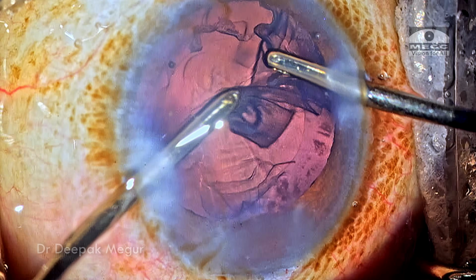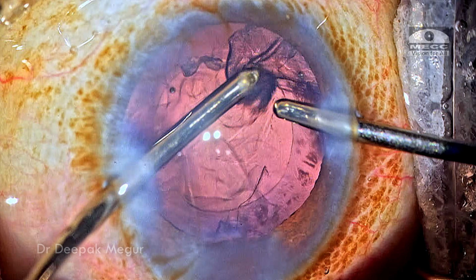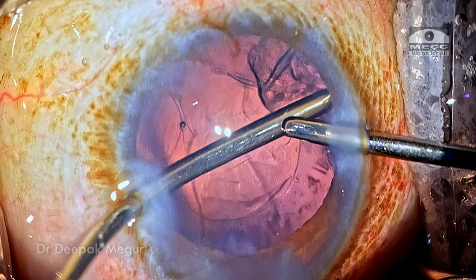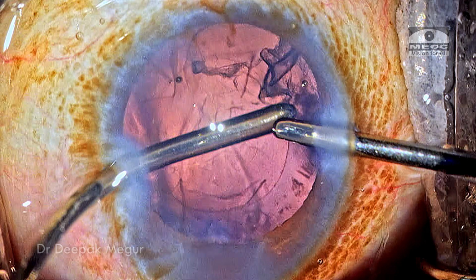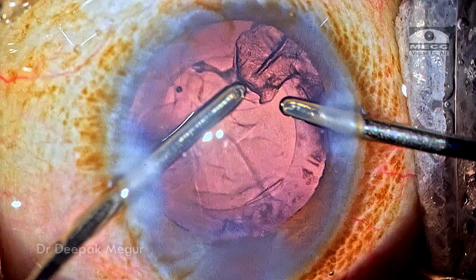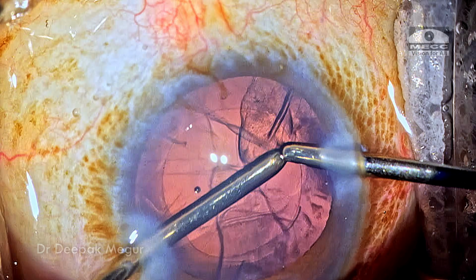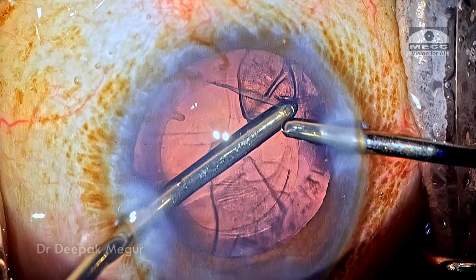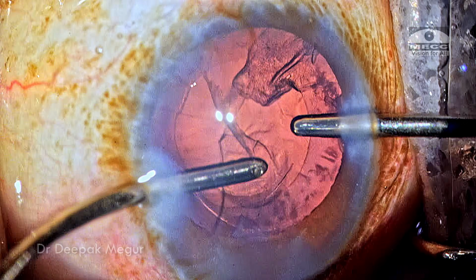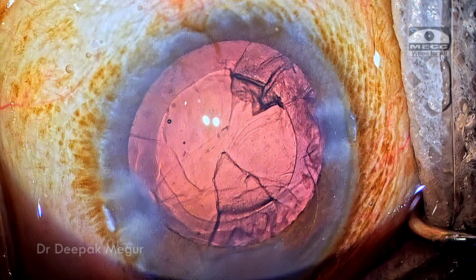But as the OVD is getting evacuated from the bag, I get a sense of positive pressure. It looks like the posterior capsule is being pushed anteriorly. This could be possible because there could be some amount of fluid misdirection trying to push the posterior capsule forward, because the fluid would have gone behind the posterior capsule, and in the presence of an anterior hyaloid detachment, it can circulate behind it quite easily and push the posterior capsule anteriorly. I want to come out and try to reassess the situation now.